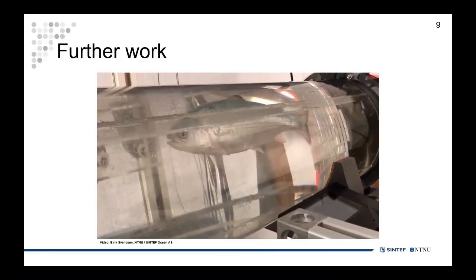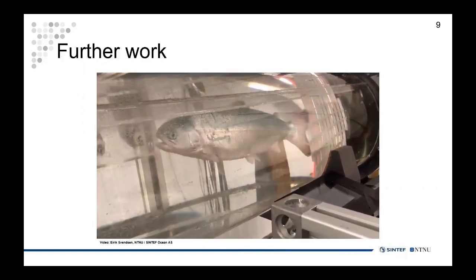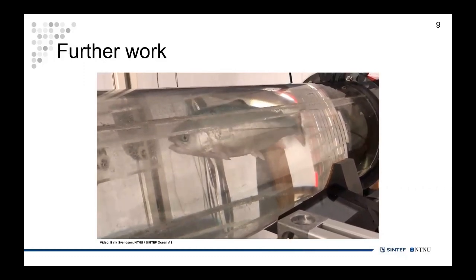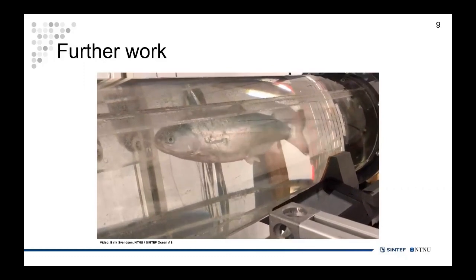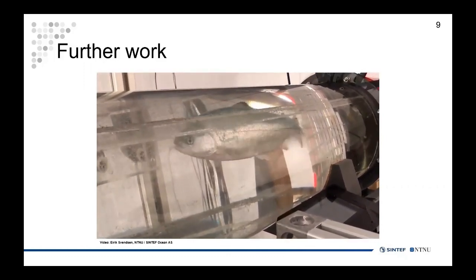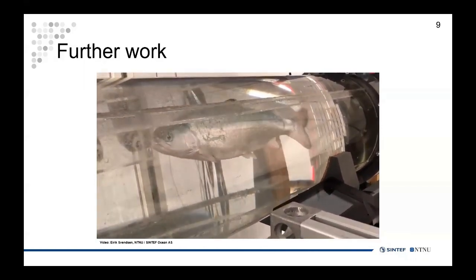This validation involves testing our implant in fish swimming in a controlled environment, such as the swim tunnel seen here. Such tests are important because we expect motion artifacts to affect the PPG. These effects must be investigated, and when we know more about their characteristics, a compensation approach using the inertial motion unit and appropriate filtering techniques must be developed.